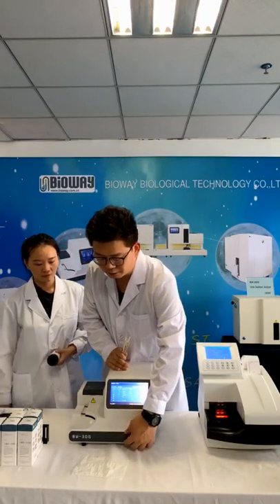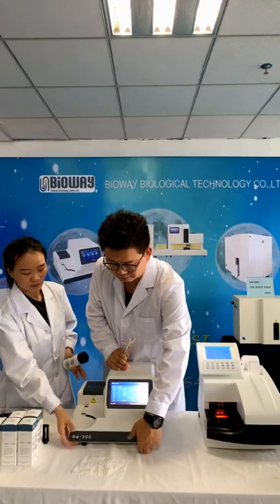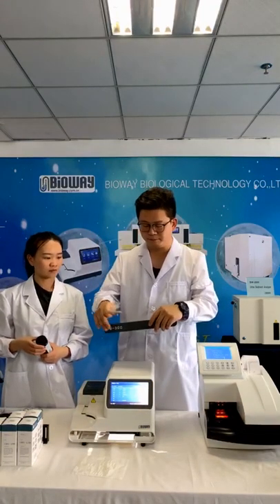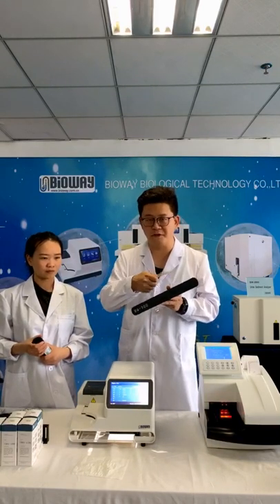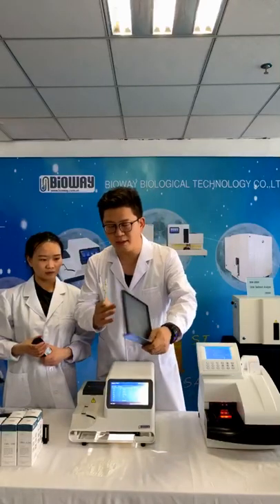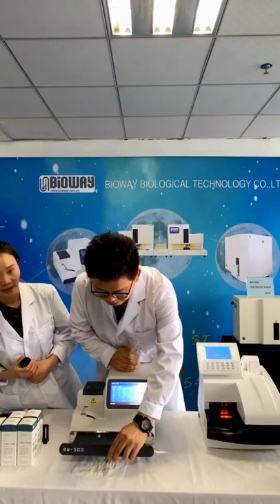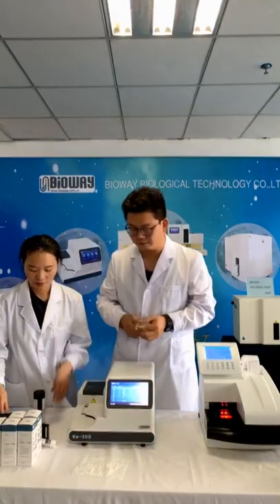And as a routine, you just need to clean this bottom panel, which collects the waste liquid, once a week. You can use a little brush and clean this surface. When it's dry, put it back. Just like this.